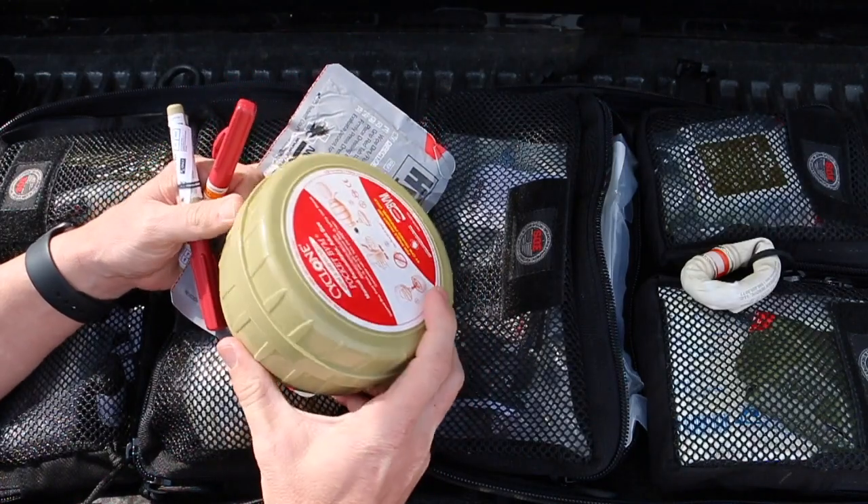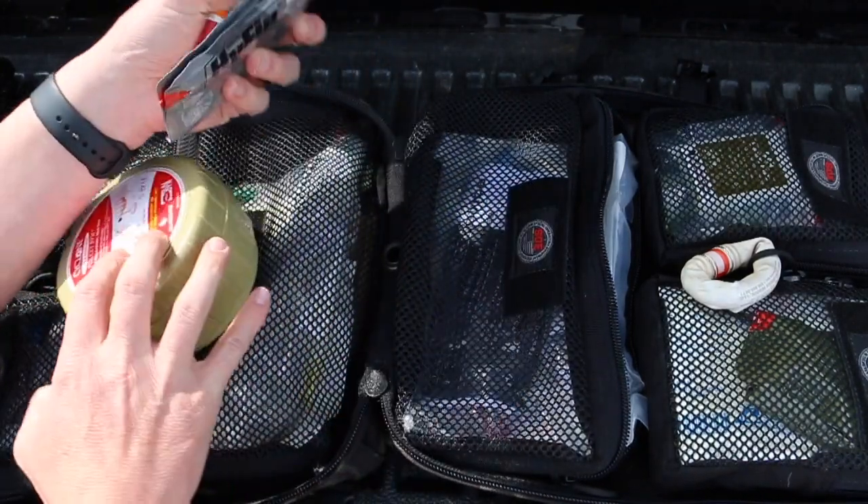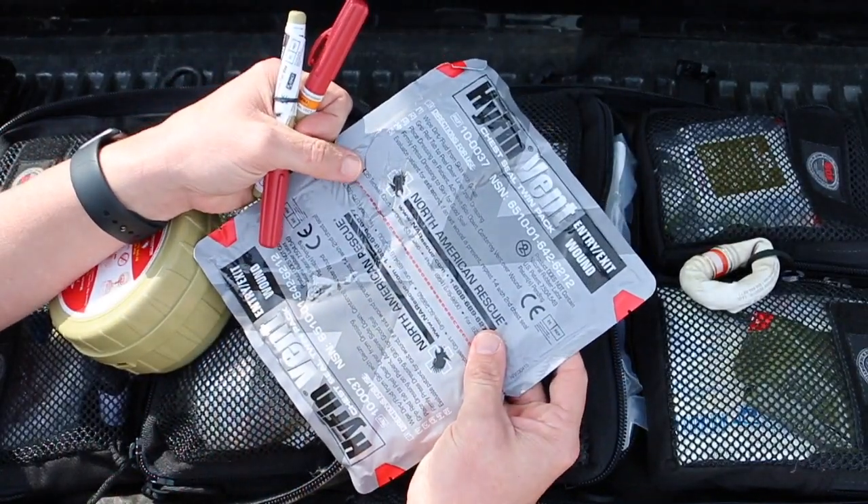I also have a bag valve mask — this is one of the pocket editions, so it's a super small adult BVM. And dual vented chest seals as well.